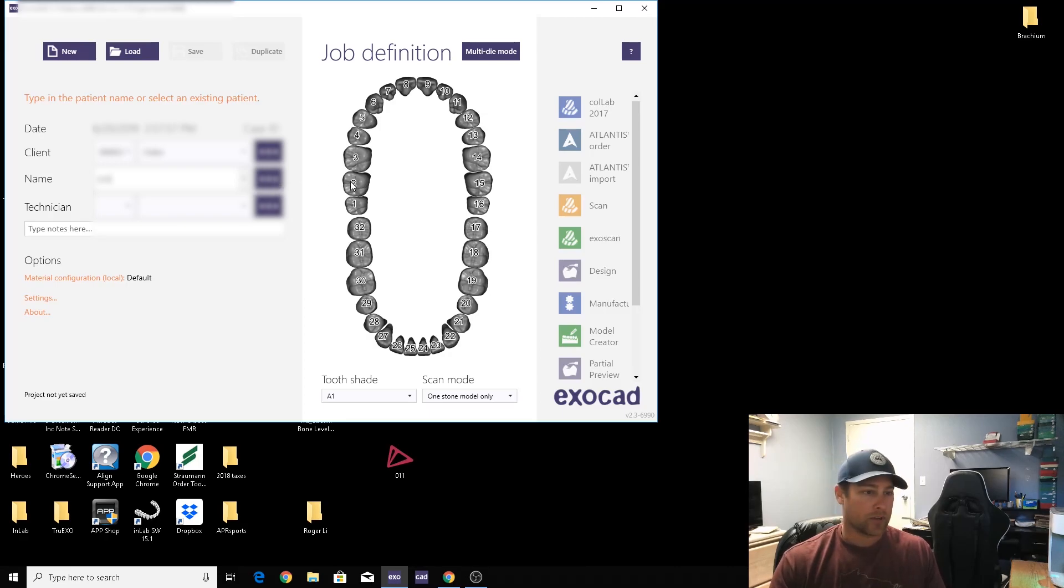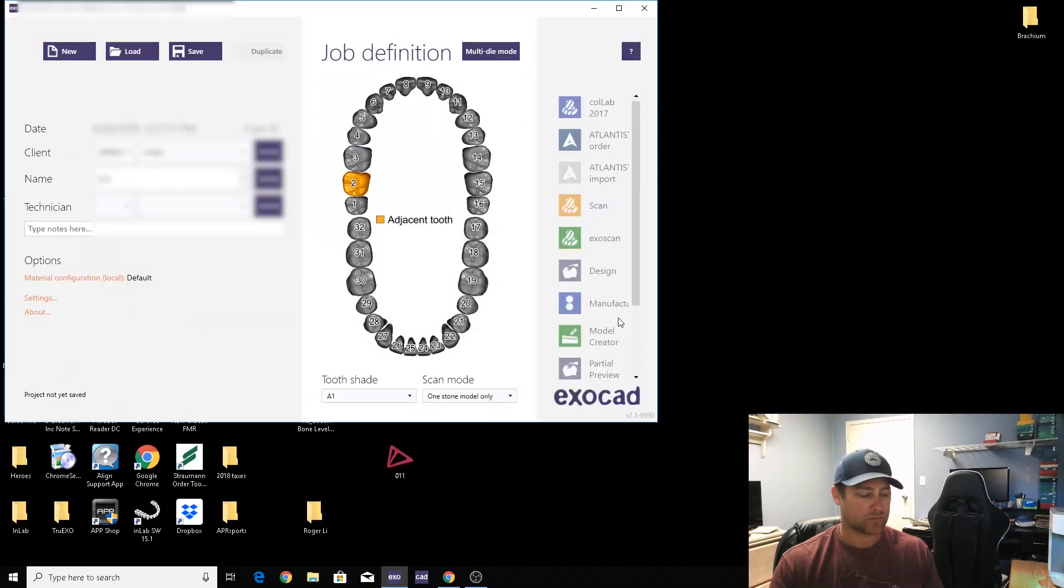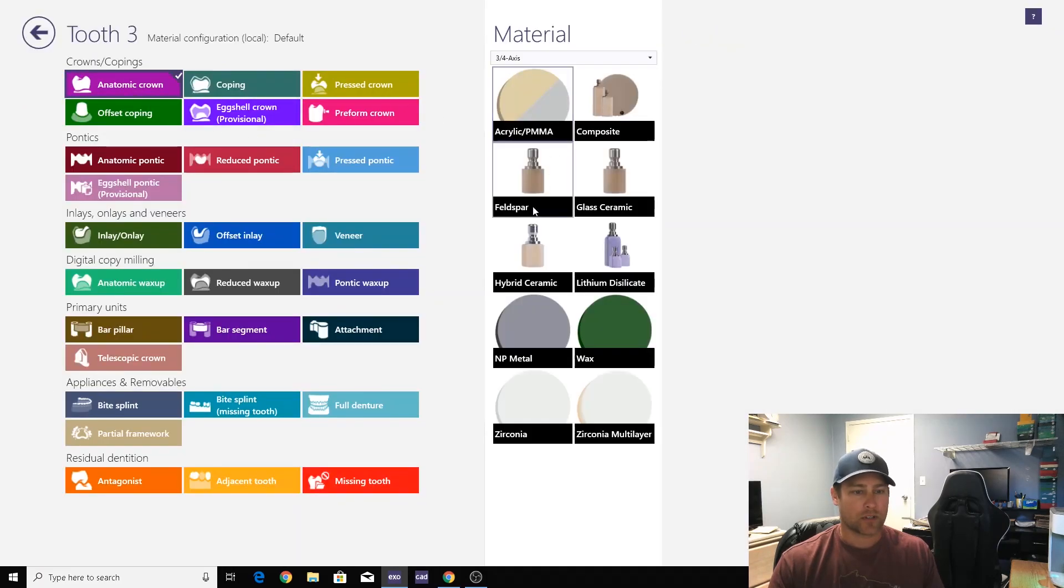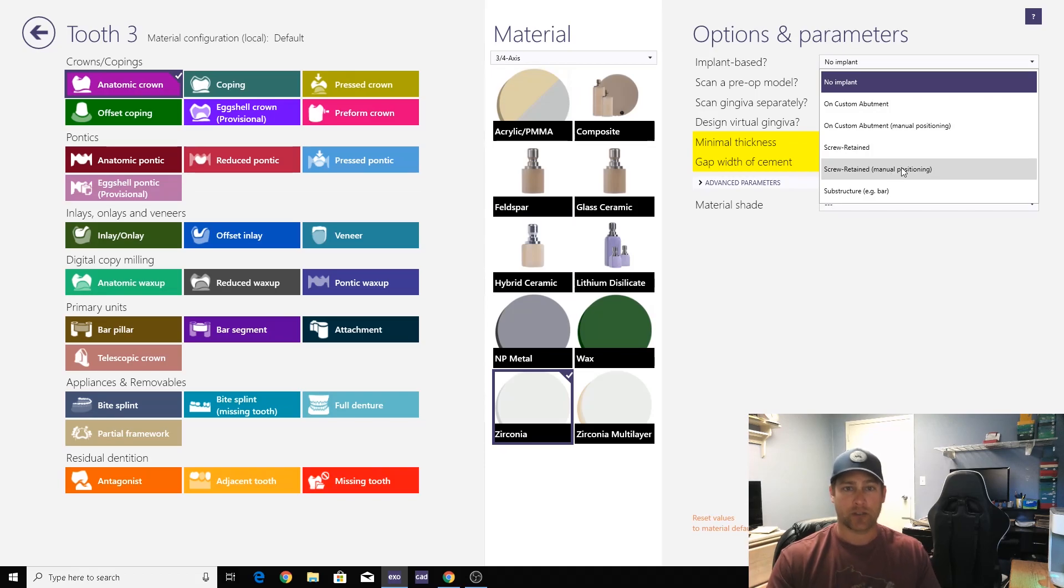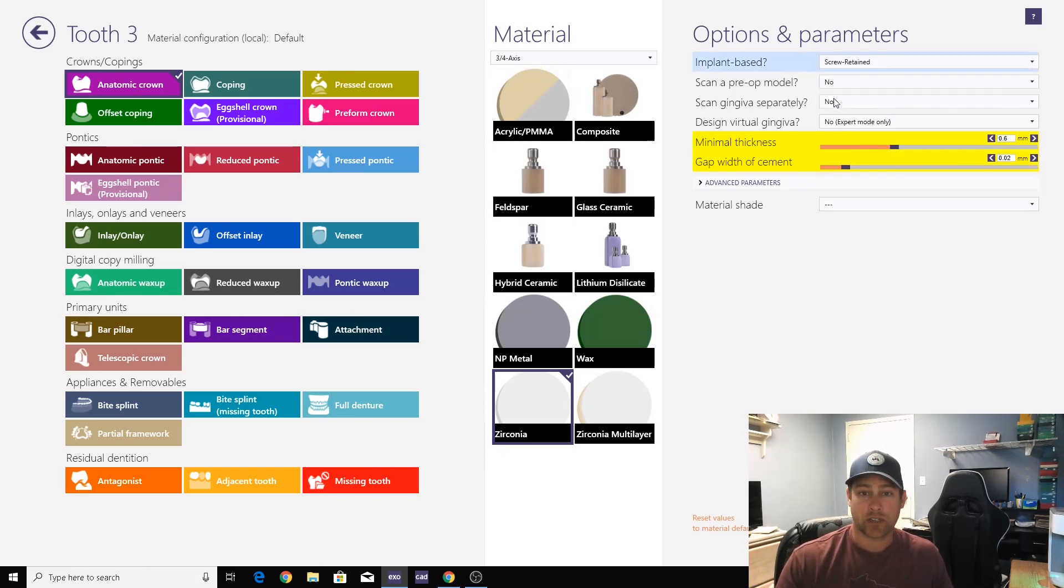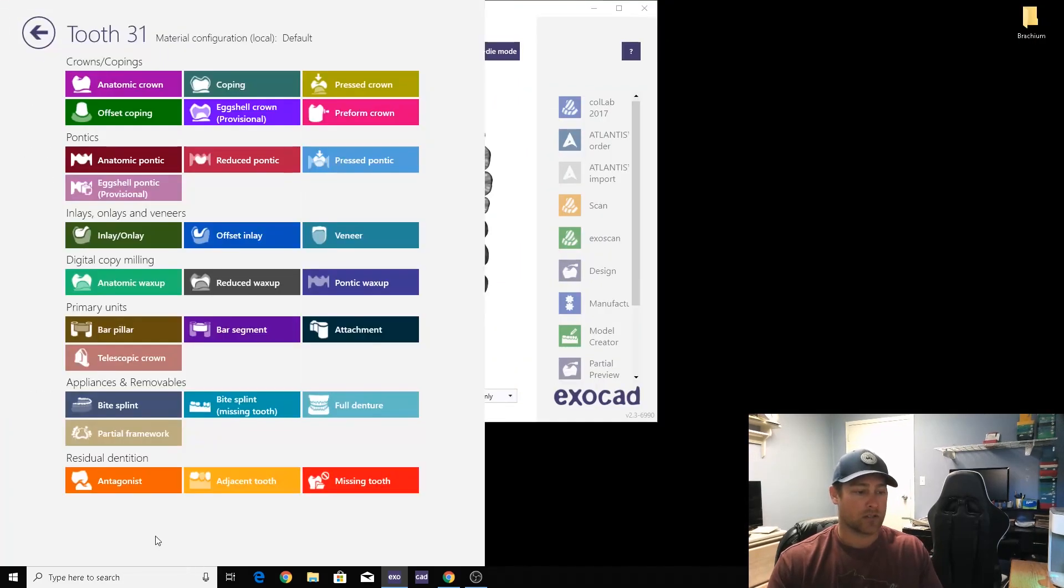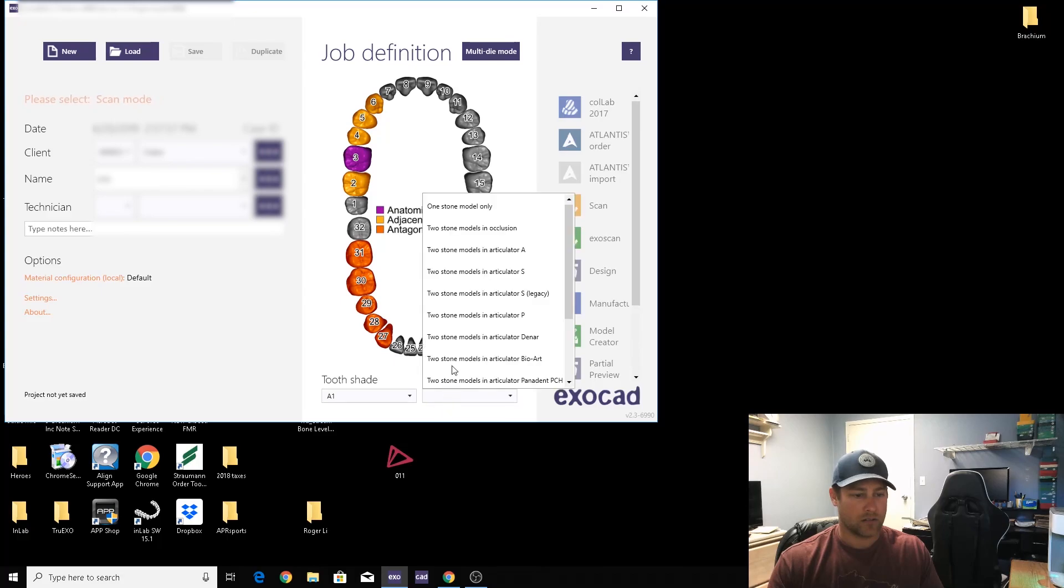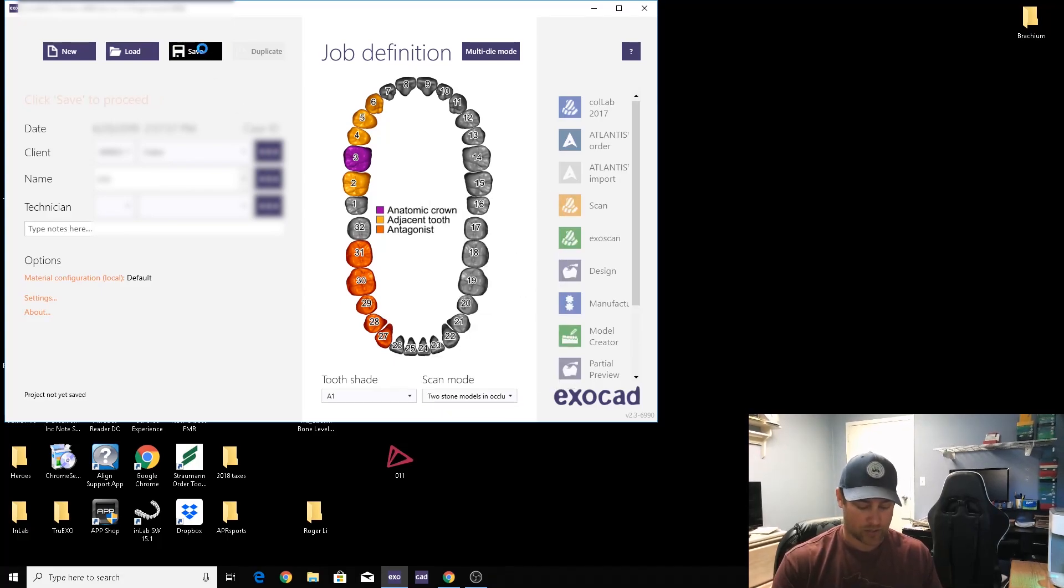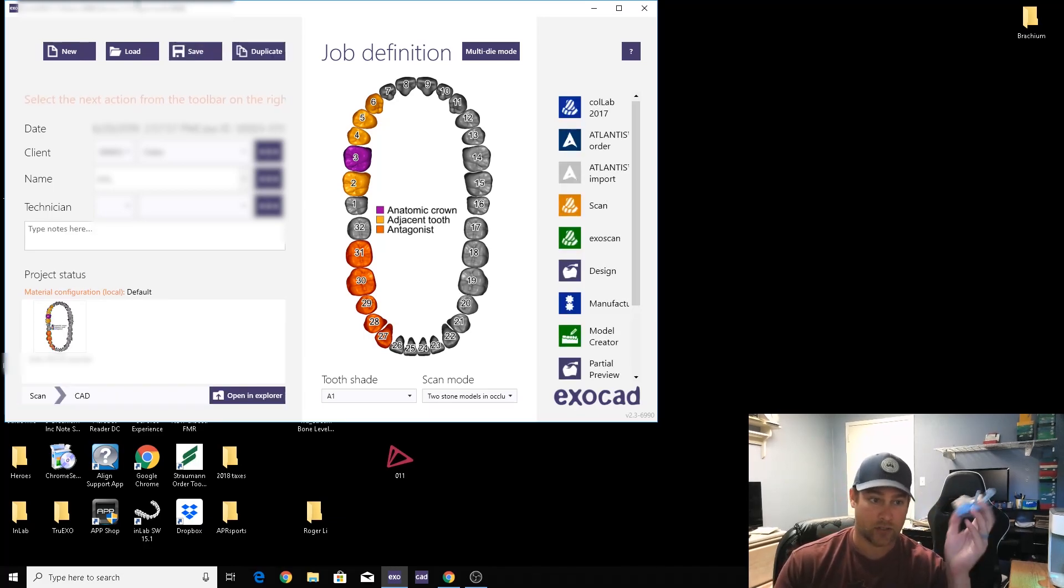We'll go ahead and get started here. We're doing number three screw-retained atomic zirconia. I'll go over in another video what manual positioning is, but we're going to screw-retain it. We're going to scan the gingiva.